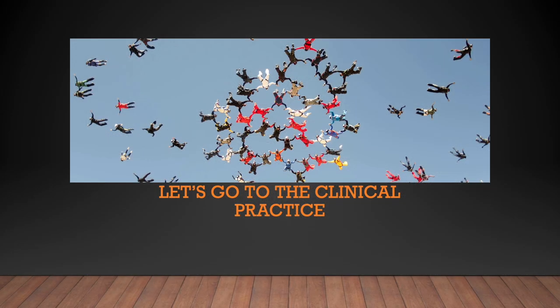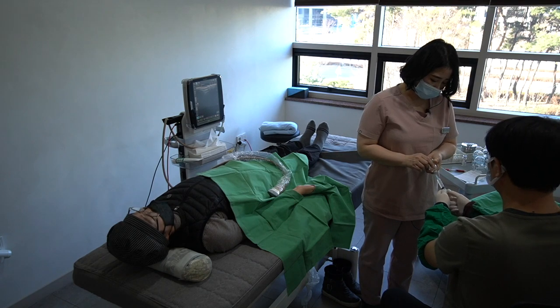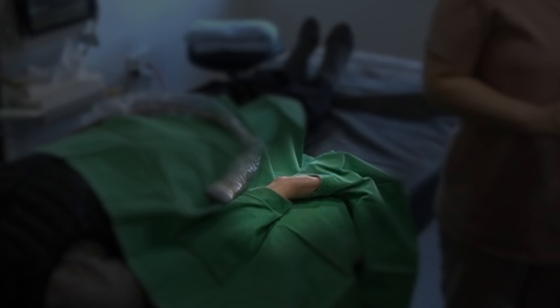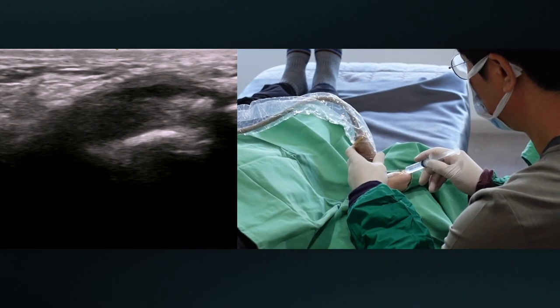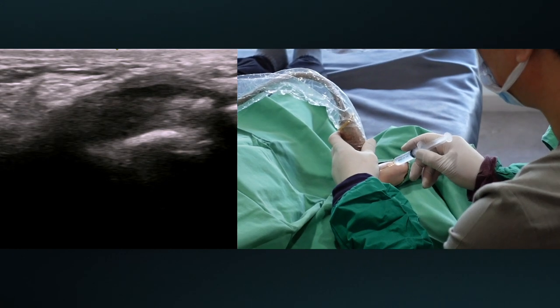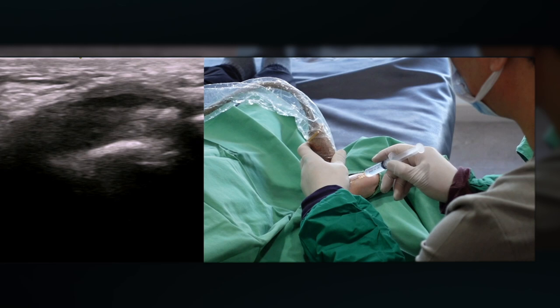Let's go to the clinical practice. Place the patient's hand in the palm-up position. Support the wrist from the back with a towel to extend the wrist. I infiltrate local anesthetic to the superficial area of the transverse carpal ligament and subcutaneous tissue.